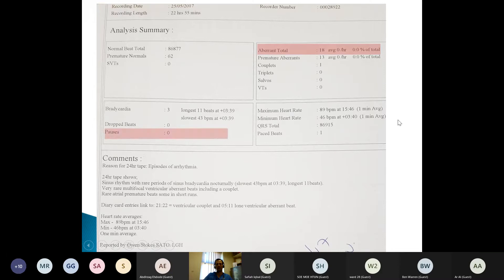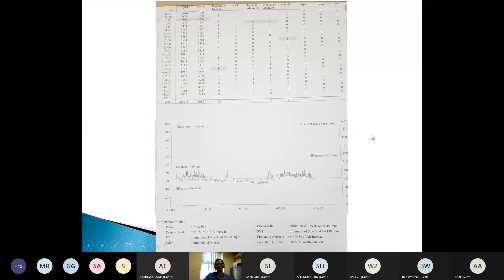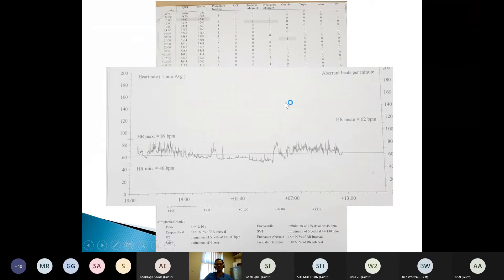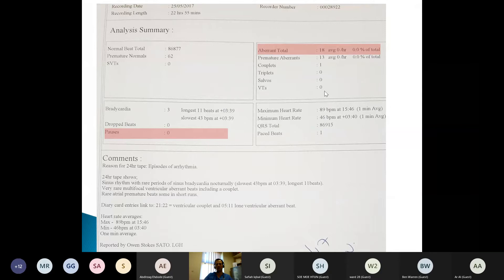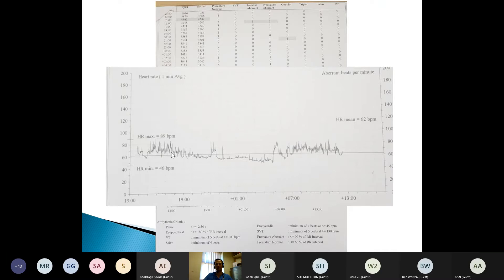The next page is the most useful page of the whole report. You want to look at the heart rate profile over the 24-hour period — heart rate over here, rates over 80, going up to 89, minimum going down to 46, and a mean heart rate of 62. This solid line is the mean heart rate. You can see the heart rate is quite variable — it changes throughout the 24-hour period and dips during the night. That's normal — it's supposed to dip during the night. A young person very often will have their heart rate go down to about 30 overnight. This heart rate variability and nocturnal dip tells us the patient's autonomic function is good, and points away from them needing a pacemaker.